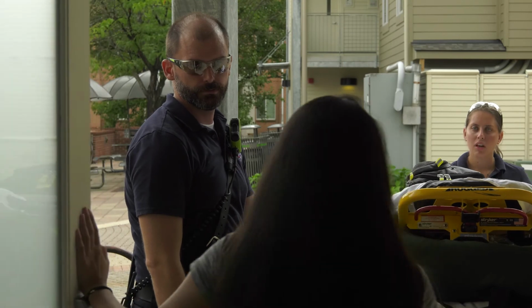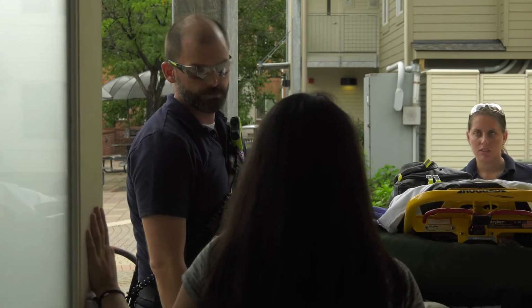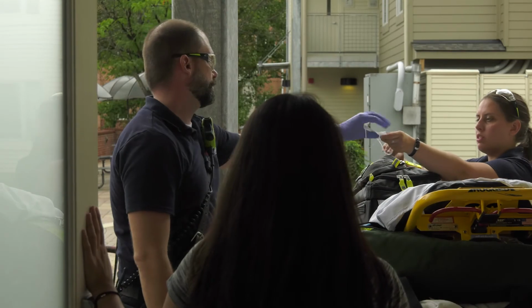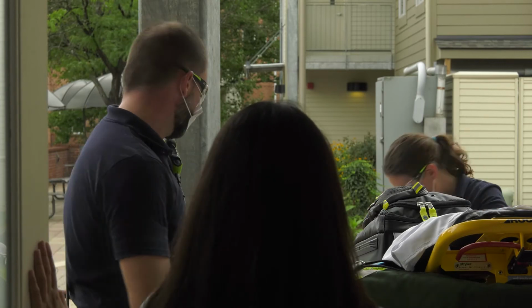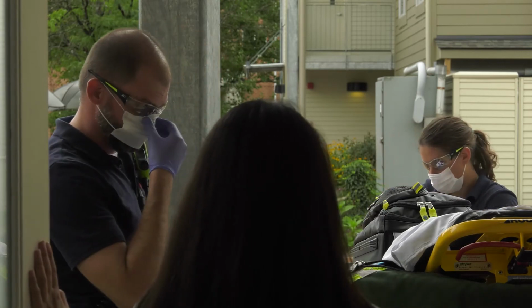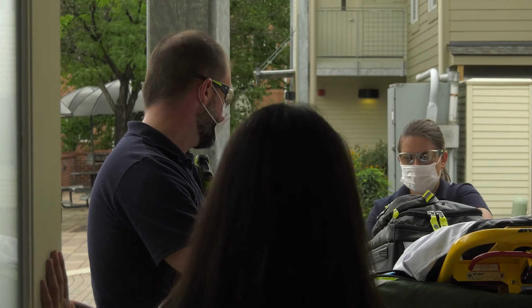Thank goodness you're here. My roommate, she's been having a lot of trouble breathing. Please help. Okay, before we come in, can you tell us if your roommate has a fever? No, she's just been having chills. Okay. All right, let's get a mask on just before. There you go. You feeling all right? Yeah, I'm okay. All right. Ready?